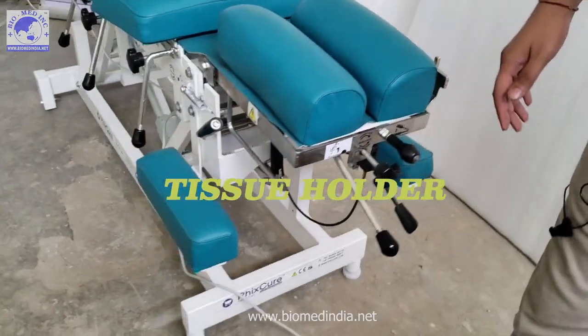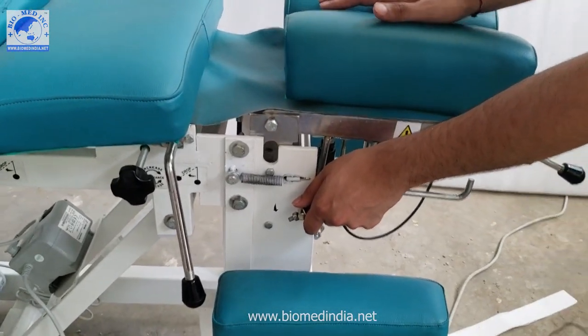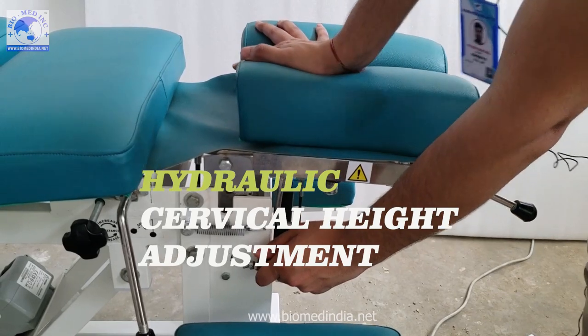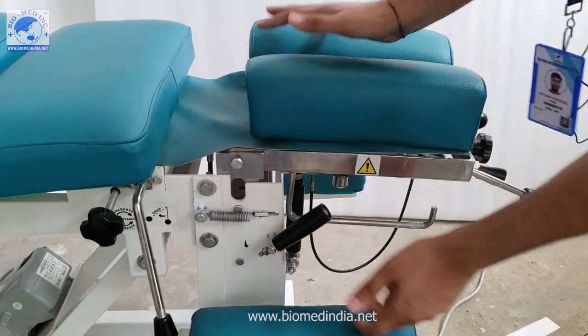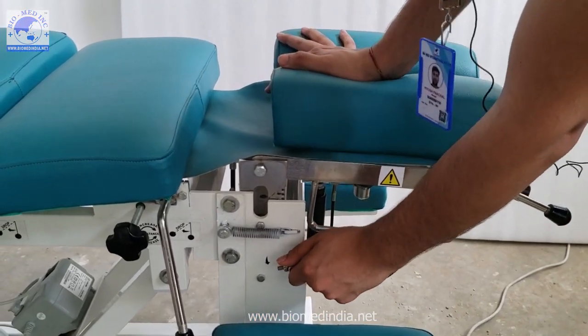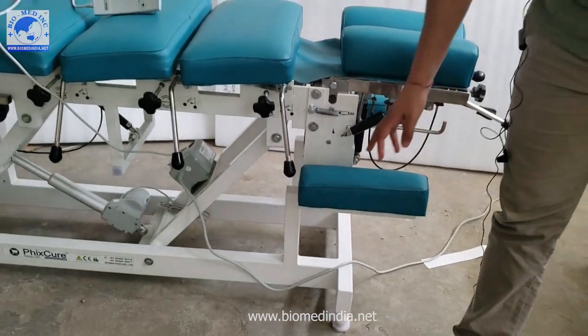Next is the hydraulic cervical height adjustment. This is the lowest height; if you want a neutral height you can set it here, or if you want full height you can raise it fully. So it's a full hydraulic cervical height adjustment system. We also have a patient hand rest system.